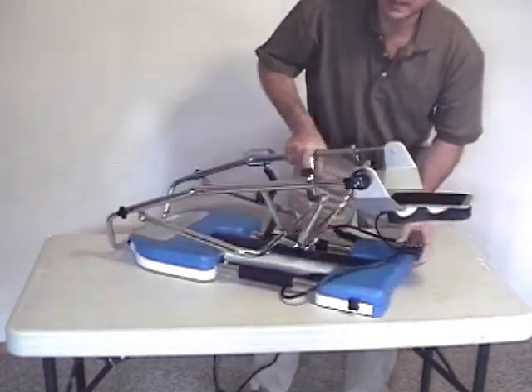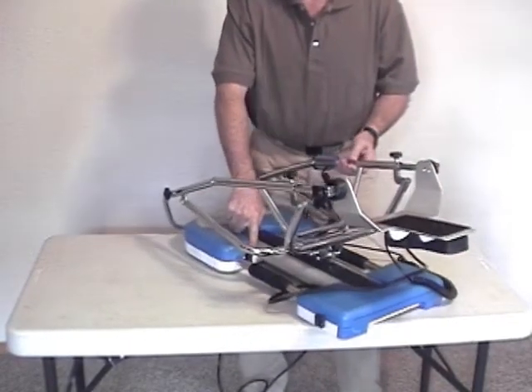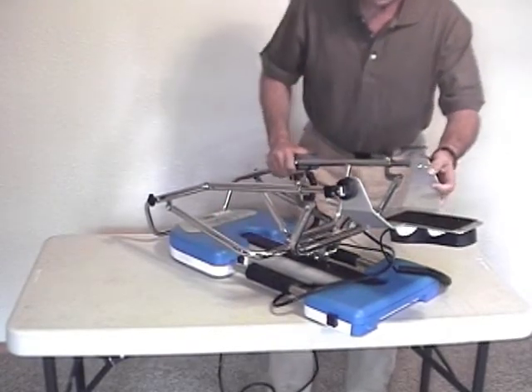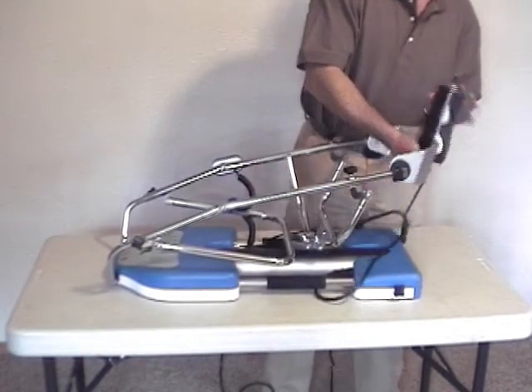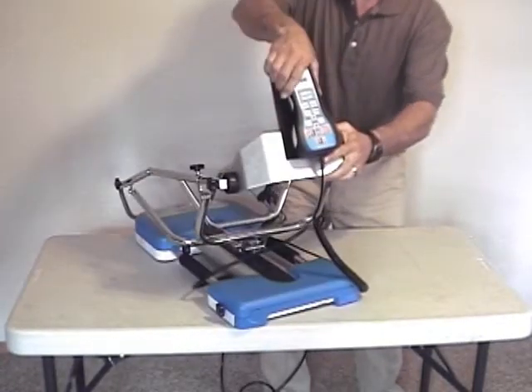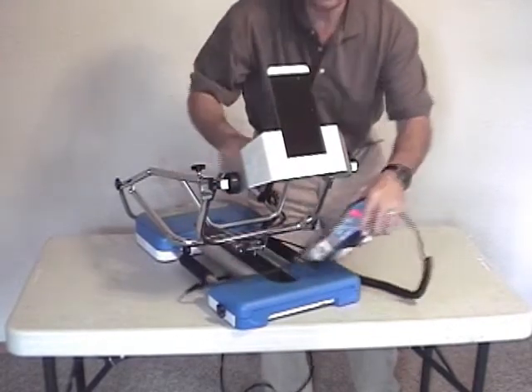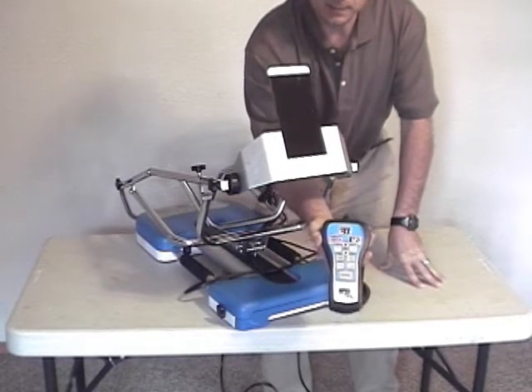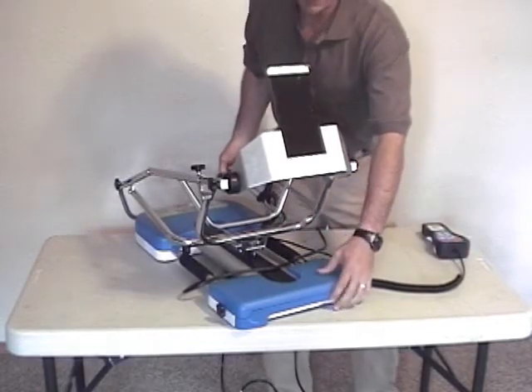Towards the other end of the machine, on the same side, is the power switch. You want to make sure that the power switch is turned on. You will know if it's turned on by looking at the hand control — when the LEDs on there illuminate, you will see that you have got the power on. We'll talk more about that hand control in a few minutes.